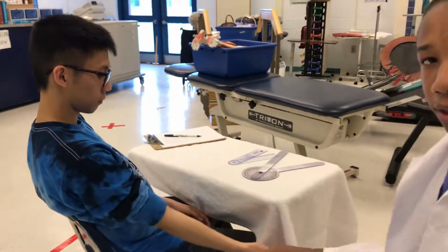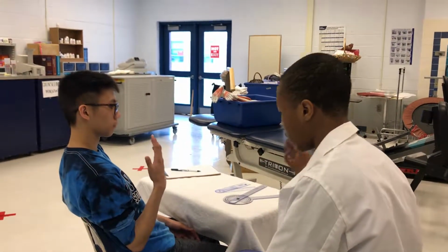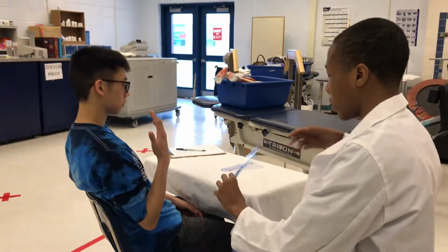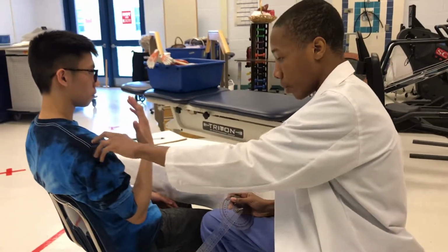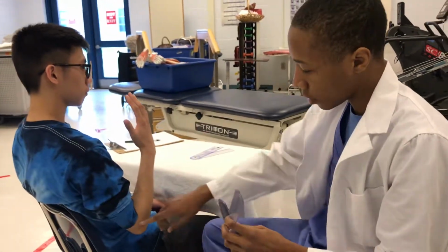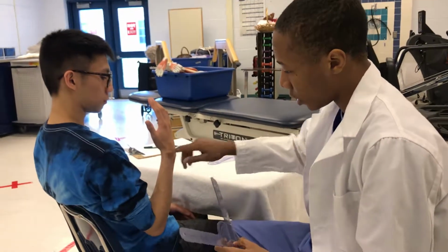So now I'm going to ask the patient to bend their elbow into flexion. So it should look like this. And I'm going to align the stationary arm with the acromion, and the axis with the lateral epicondyle, and the radial styloid with the movable arm, which is here.